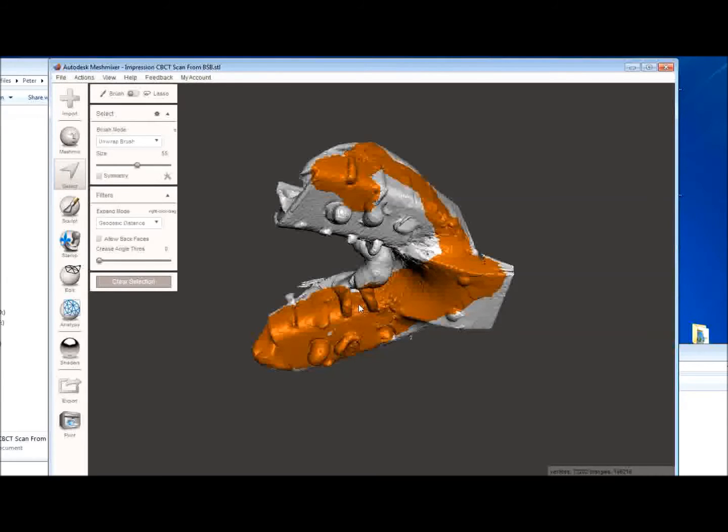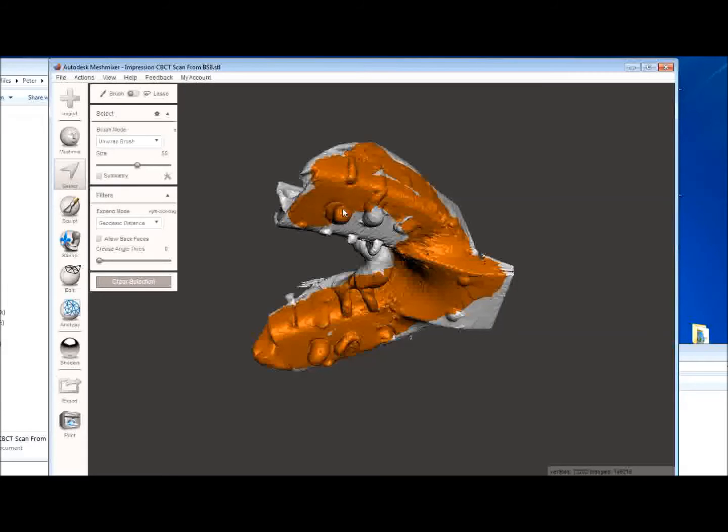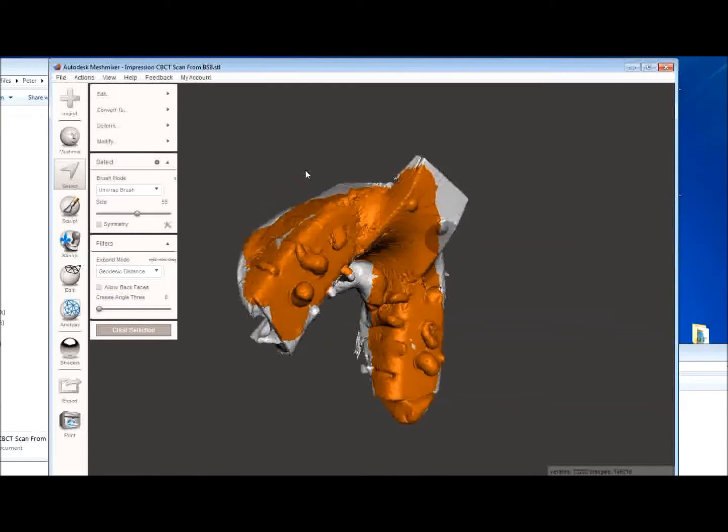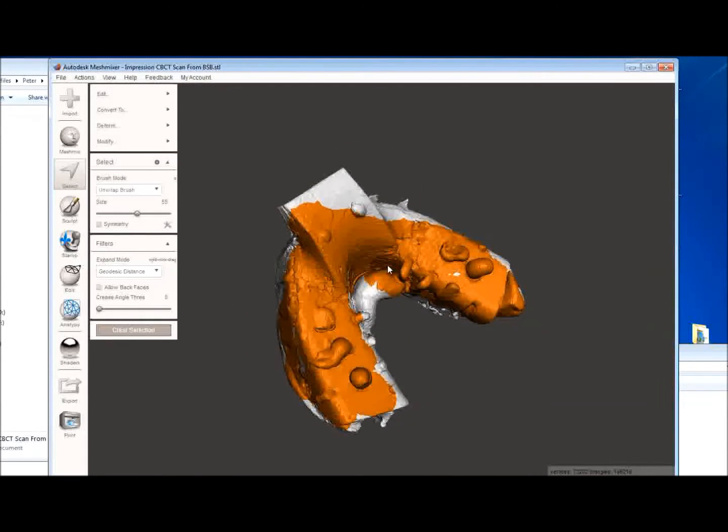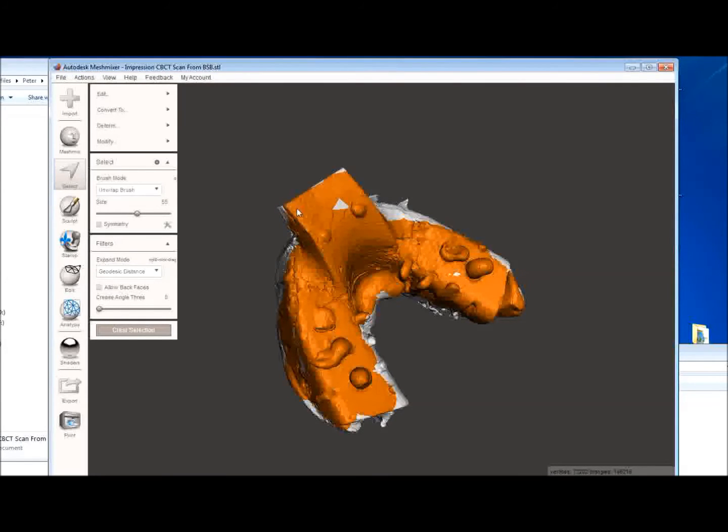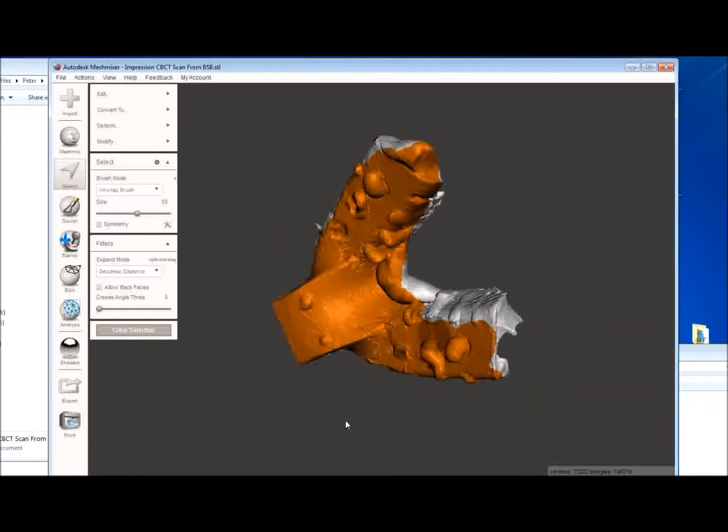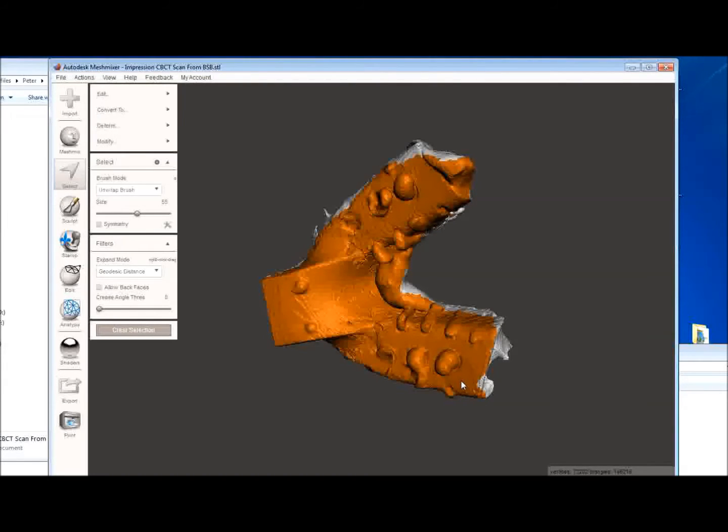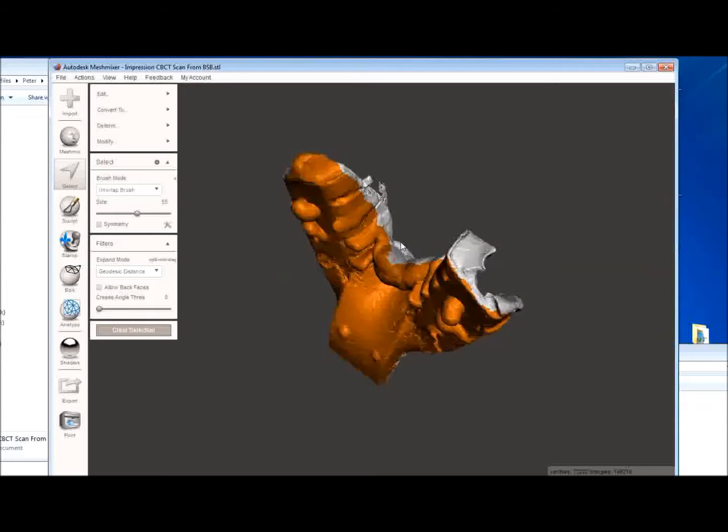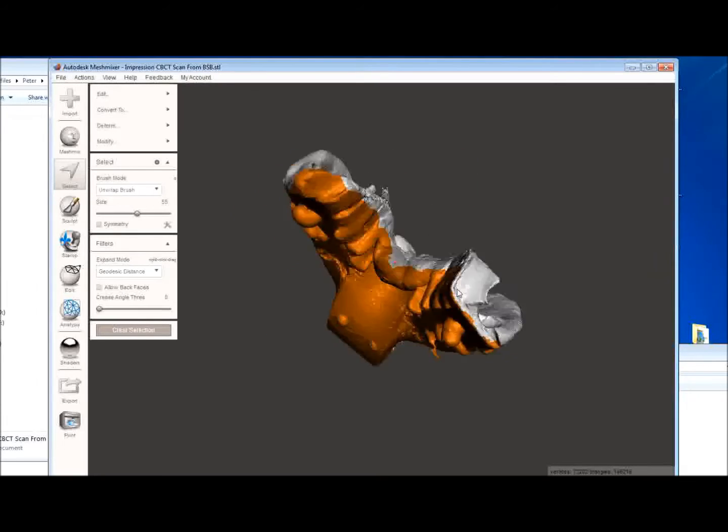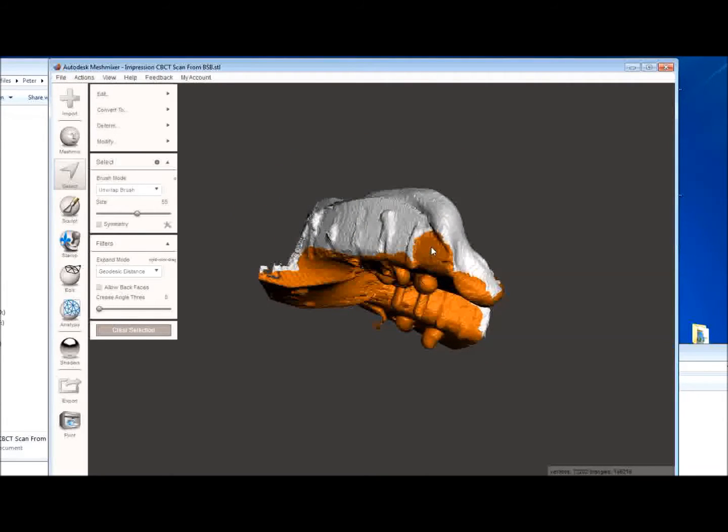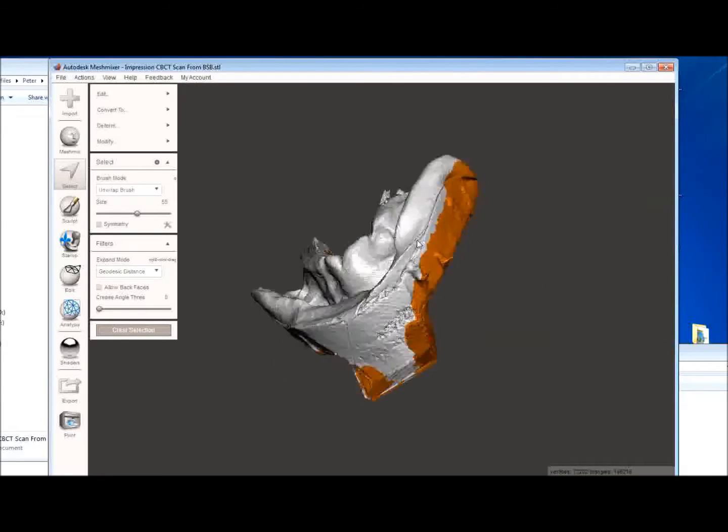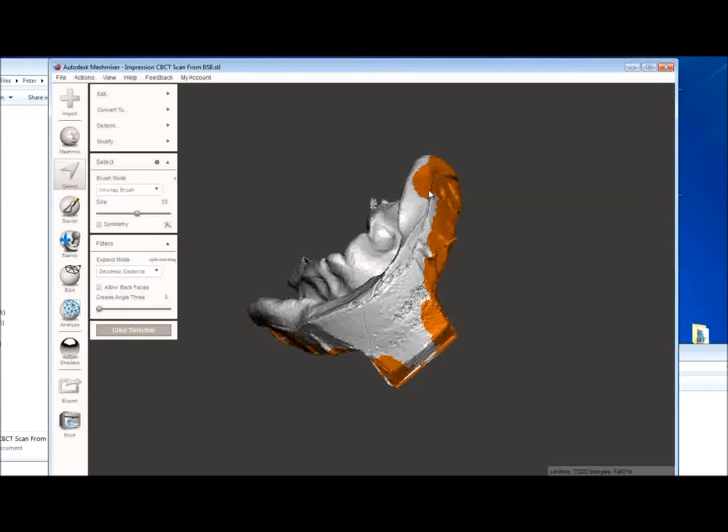This time I'll be a little bit more careful so that I don't leak over into the teeth or into the vestibule. And we'll just paint away those areas here. You don't have to be exact because you can always go back and cut away areas later using the software. So that's looking pretty good. This time I didn't leak over. Just being a little bit more careful.